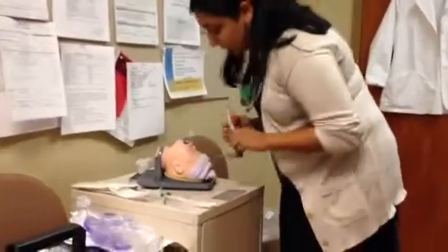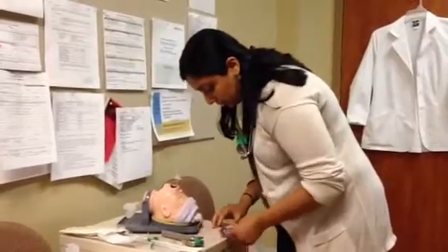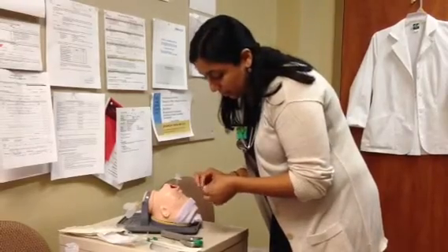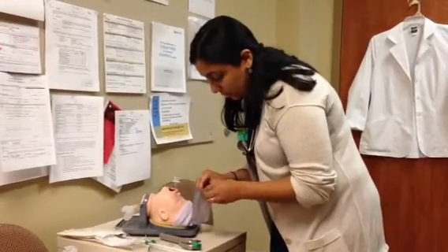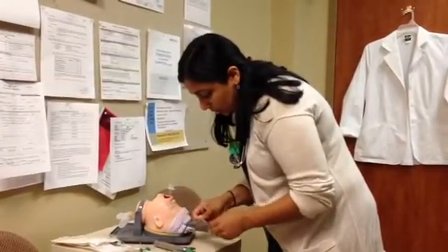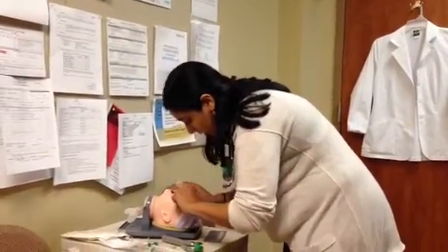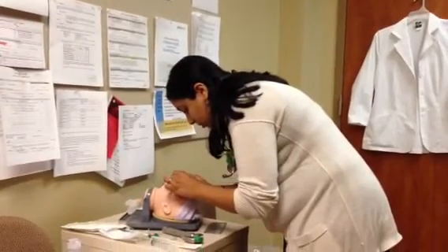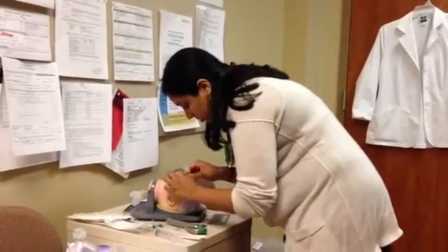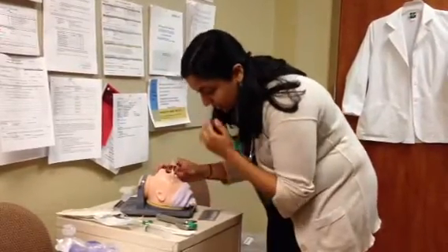Okay. So this infant is currently intubated at 10 at the lip. This is important to note just because you want to ensure that the NG tube you're going to insert after you intubate is 1 centimeter shy of the measurement at the lip. So if we're inserted to 10 centimeters, the NG tube needs to be inserted to only 9. So the ET tube does need to remain in a fixed position. So at this point, we will just go ahead and tape the ET tube in place. So ET tube is fixed at 10 at the lip.